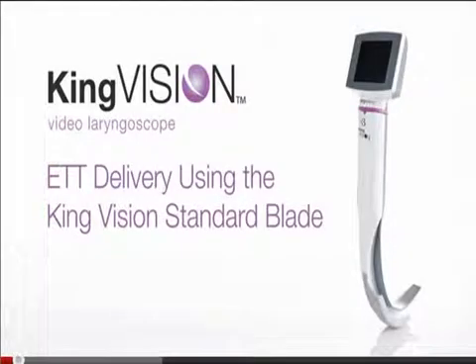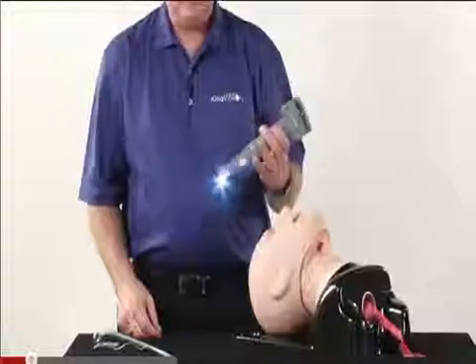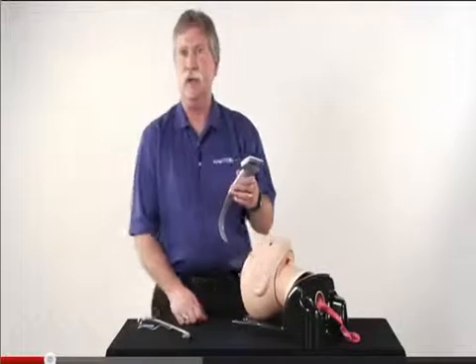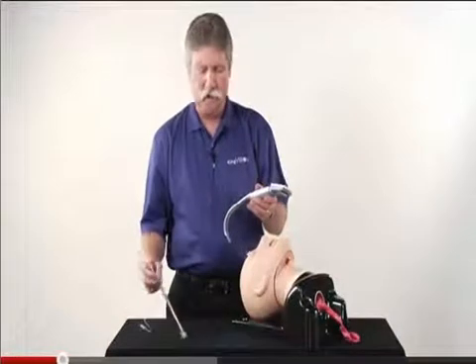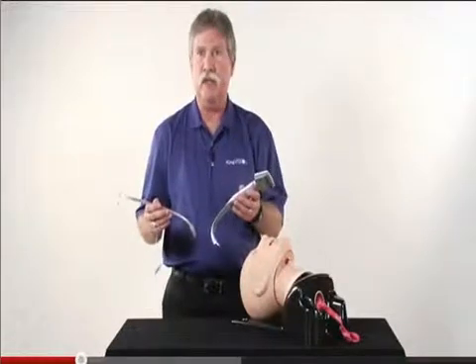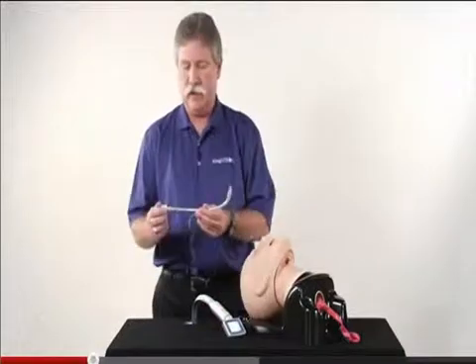In terms of the use of the standard blade with the King Vision video laryngoscope, it's important to note that the mouth opening requirement here is only 13 millimeters. So it does give a little bit of versatility in accommodating smaller mouth openings. The lack of a channel means that you are going to need to use a stylet to indirectly manipulate the tube into position. Now, three things to remember in operating the stylet.